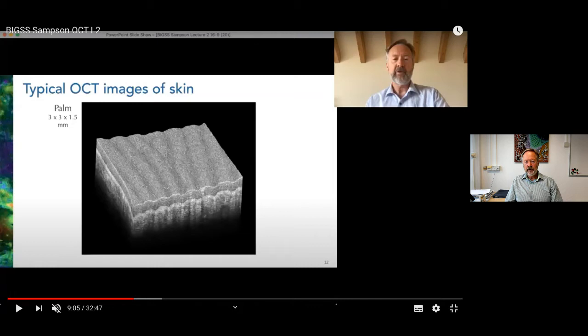If you look at linear scale OCT images, you lose quite a lot of information. So log scale helps to bring all of these scatterers up together. Part of that is just because you have such strong extinction with depth. You have 50 dB between the surface and a millimeter in depth. And you want to capture all that image information in a single system and view it at a single instant in time. So yes, usually they're logarithmic scale.